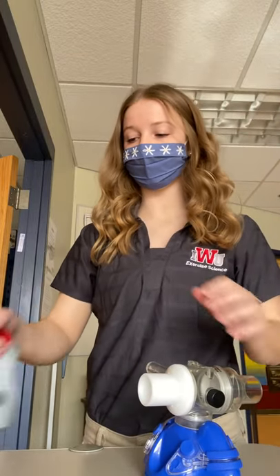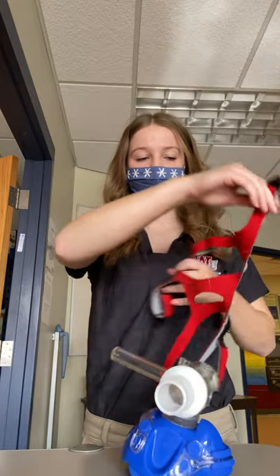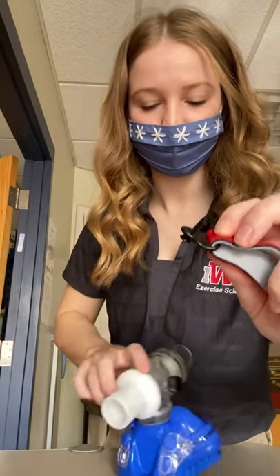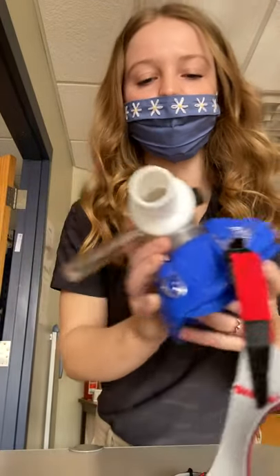Now we're going to connect the mask to the head strap. You want the red side to be touching the participant's head, so the gray is going to be on the outside. Take these little black knobs and put them into the little plastic hooks on the outside.